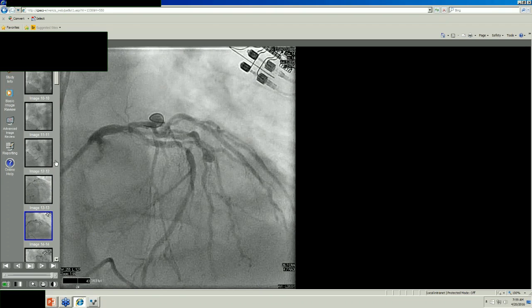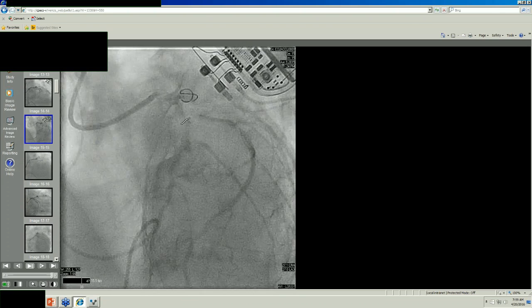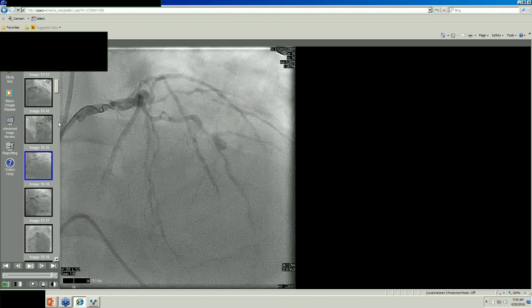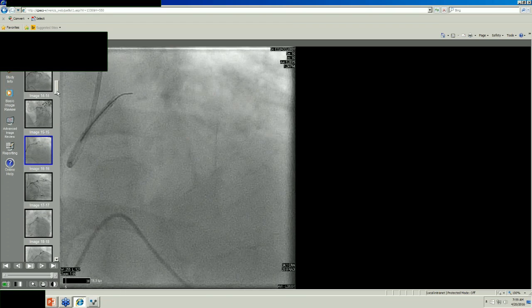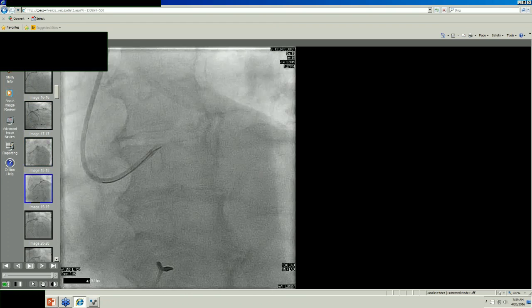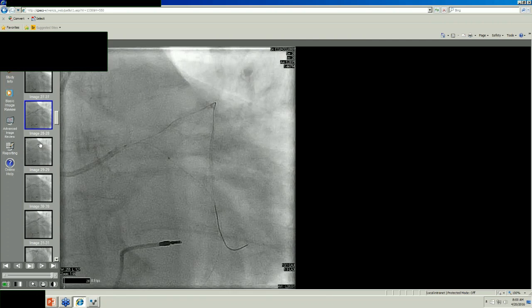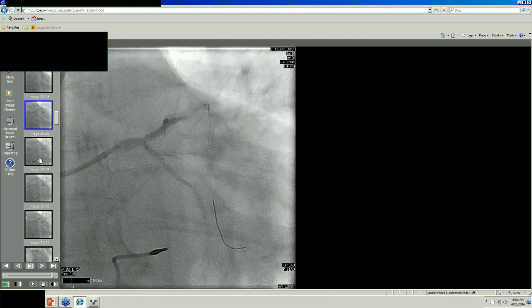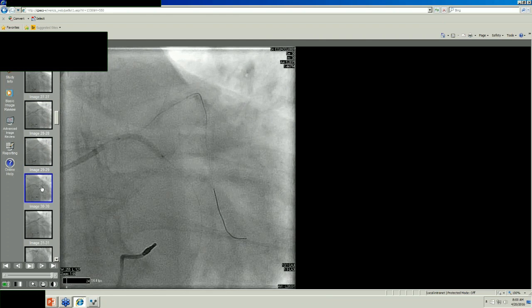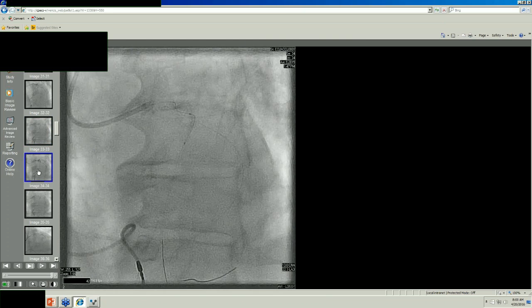And here we go. This is a high-risk procedure. We're coiled in a little aneurysmal area there. Main left, unprotected disease. Getting a stent is considered a high-risk procedure. That's what we're doing. So cross your fingers on this one. We've got wires everywhere. We got stents being deployed.